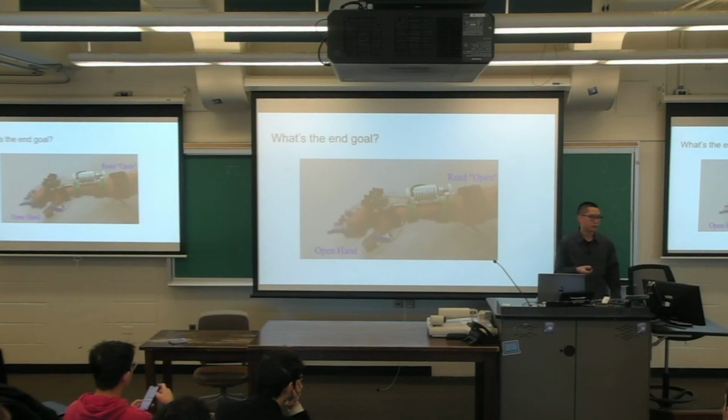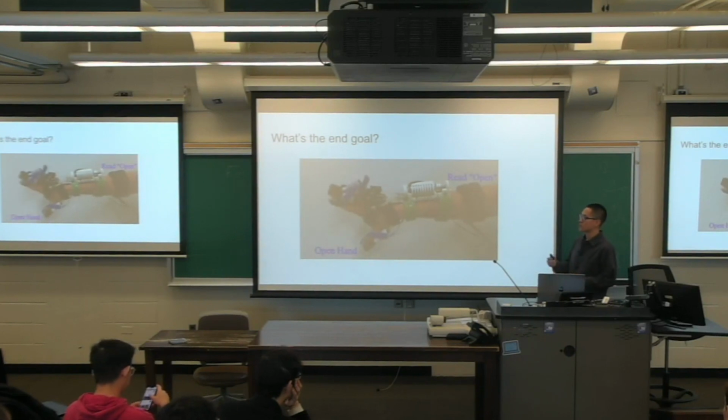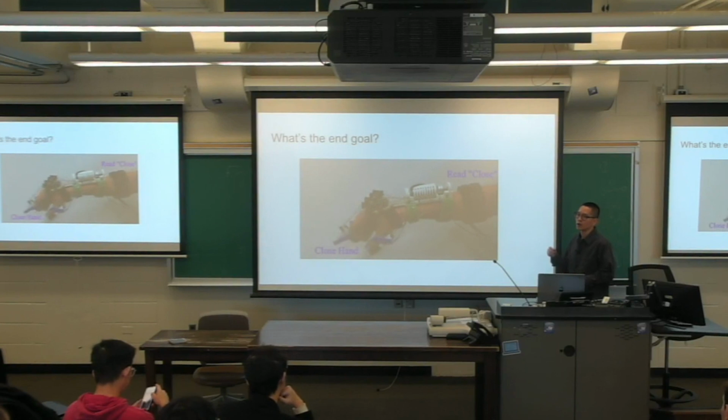If the algorithm thinks the patient wants to open their hand, the motor moves and pulls the strings and helps them open their hand. If the algorithm thinks the patient wants to close their hand, it will send a close command to the motor, which releases the string, and then the patient can use their own strength to close their hand.